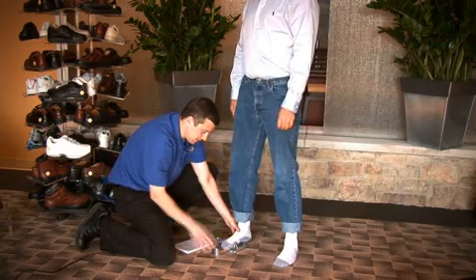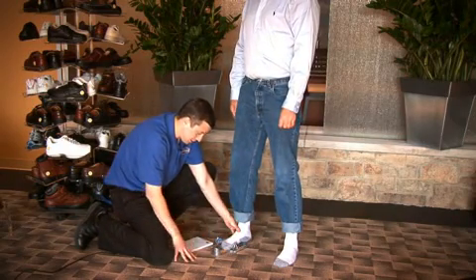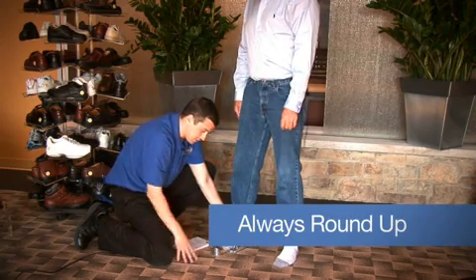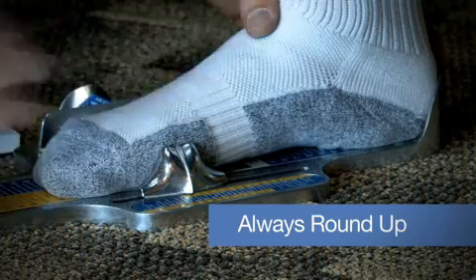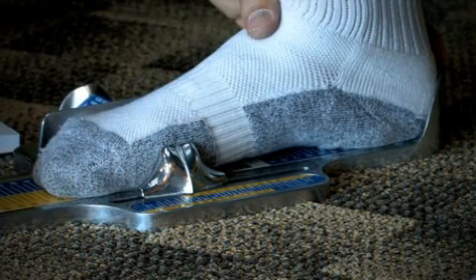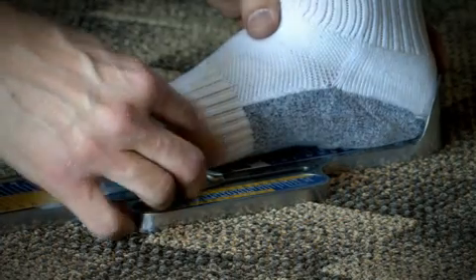Once he's made that measurement, that's when we take the calculation, the midpoint of 1 and 2. Since he's a 9.5 and a 10, you add those, divide by 2, you get 9 3/4, but we can't do that. We round up to a 10. If this patient had a heel to toe as 9 and the heel to ball as 10, we would split the difference as a 9.5. But in this case, we're rounding up to the 10.